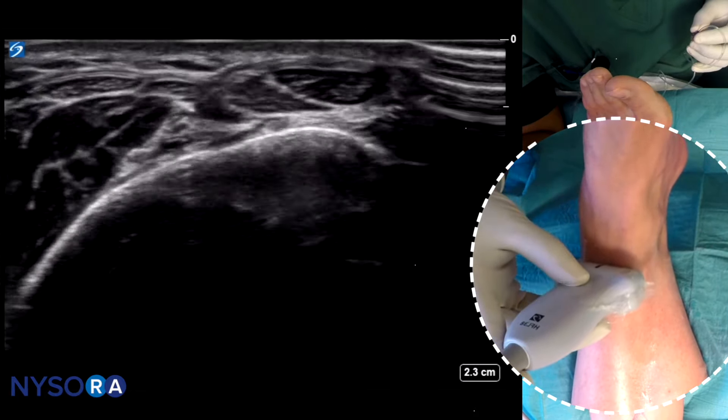We also need to do the sural nerve, so we will do one last injection for that. Very light transducer pressure is necessary so we can see the lesser saphenous vein, which is right here. That is the lesser saphenous vein, and this could be the nerve — yes, the nerve is right underneath the vein. All it takes is a couple of milliliters of local anesthetic, and mission accomplished.